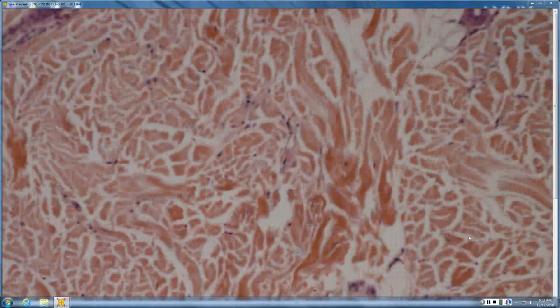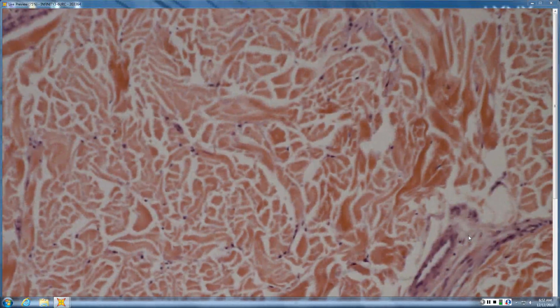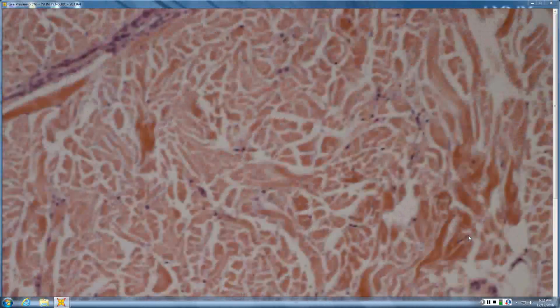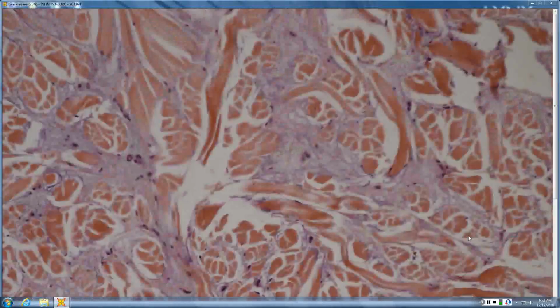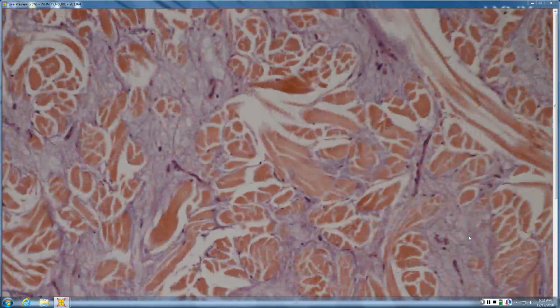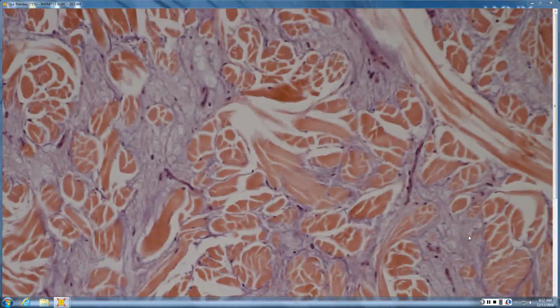What else do you notice? Does the dermis look hypocellular, hypercellular, pretty normocellular? I would say maybe normal to hypo. Okay, so I think it looks pretty normal. There's a little bit of inflammation perivascularly, but I think that's fairly non-specific. I don't see any fibroblasts or dendritic cells, right? There's not too many of them. So thick biopsy, deep deposits of dermal mucin. Scleredema. Yep, good. So this is scleredema.